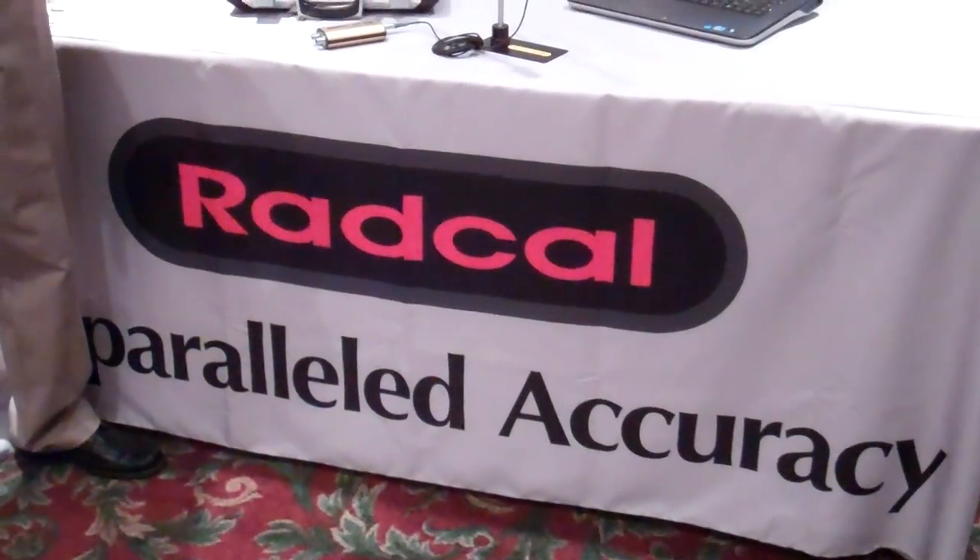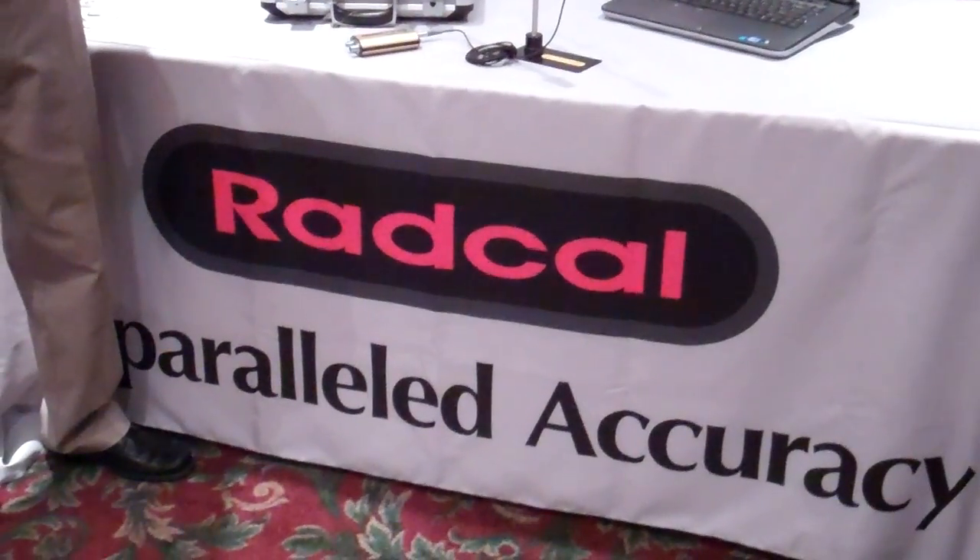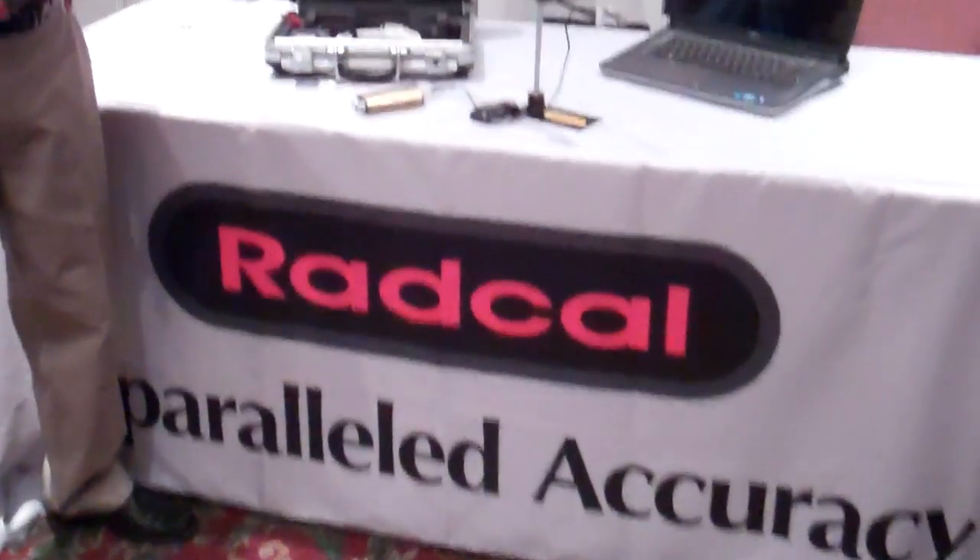I'm in front of a booth called RadCal, and what they do is imaging equipment diagnostics. So let me turn it over to Steve here — he's going to tell you a little bit about what we've got on the table here for us.